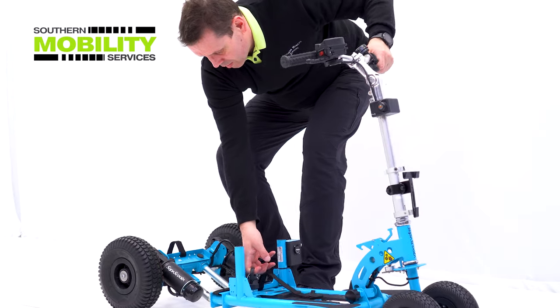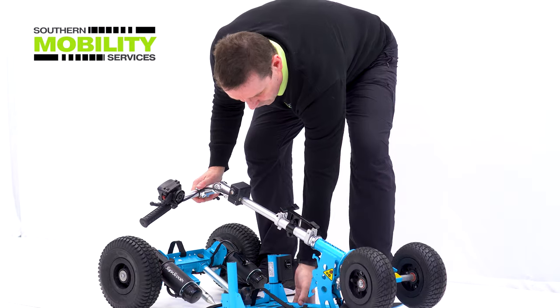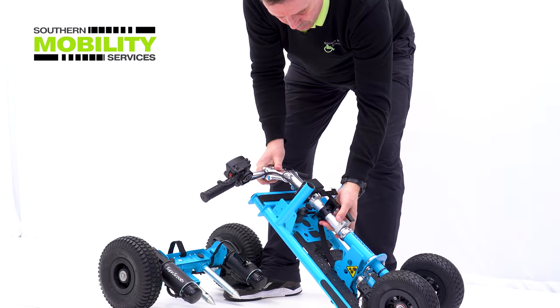Slide the front chassis from the motors, drop the tiller and lower the telescopic handlebars. And that's it, it's done.